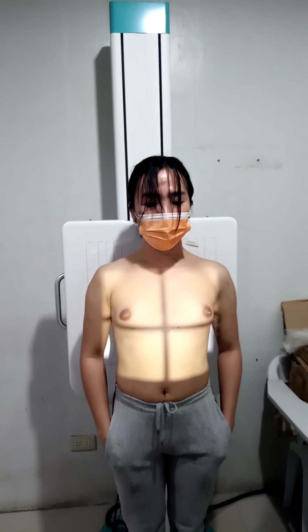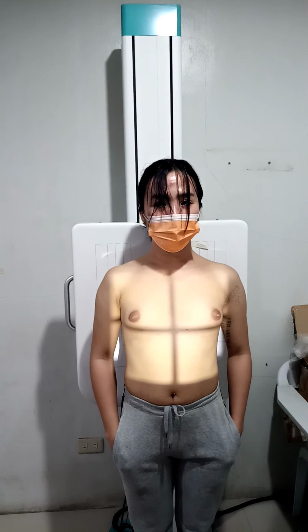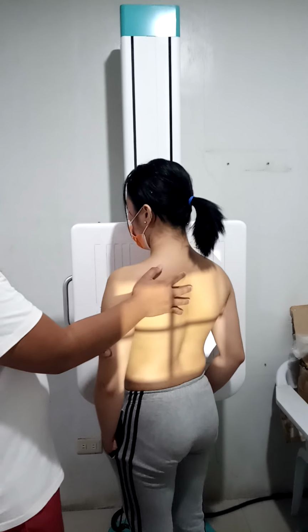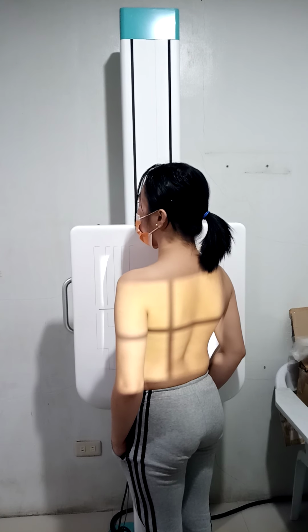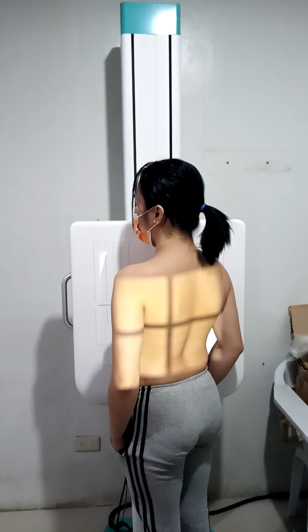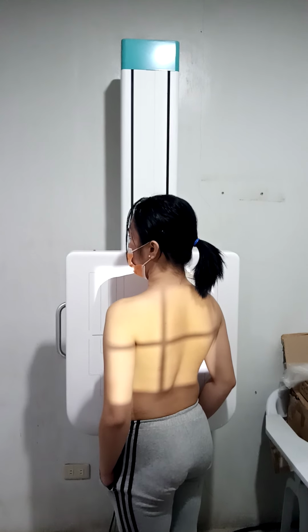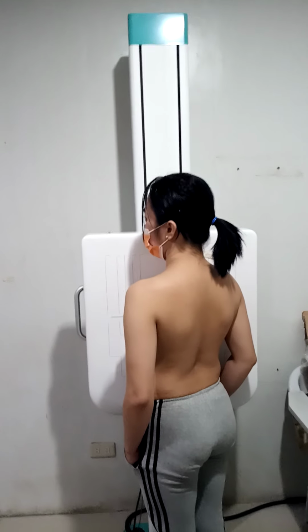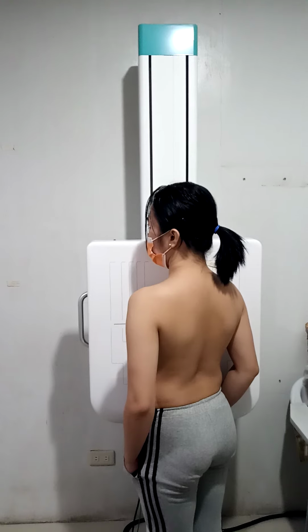Then, in part positioning, center the sternum to the grid and rotate the patient's body 15 to 20 degrees to prevent superimposition of the vertebral and sternal images. Then make sure that you center the IR midway between the jugular notch and xiphoid process at the level of thoracic 7. Always remember that you need to shield the gonads. Then, in respiration, shallow breathing or suspended expiration should be instructed to your patient.